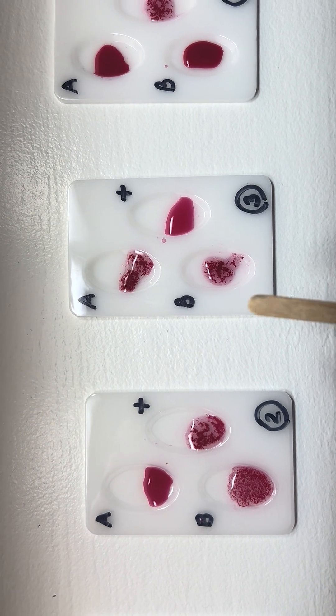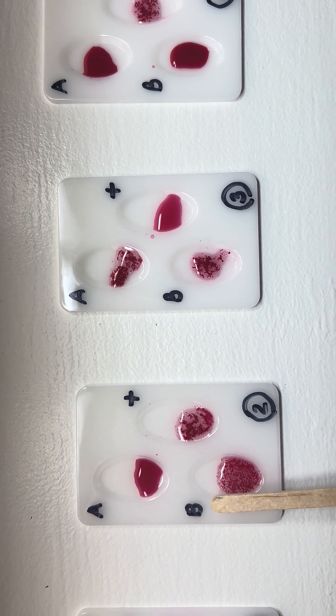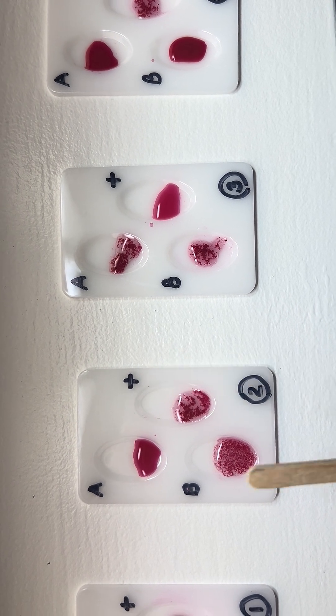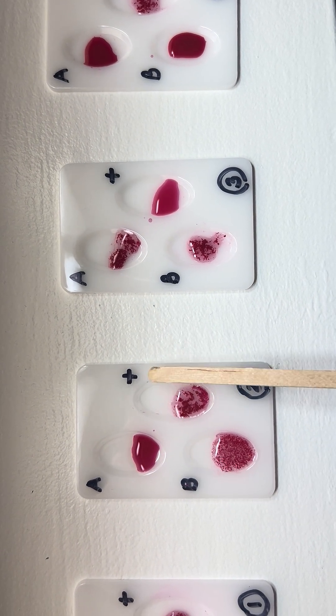In the second tray, we see agglutination in the B and the positive well — therefore this patient is B positive.